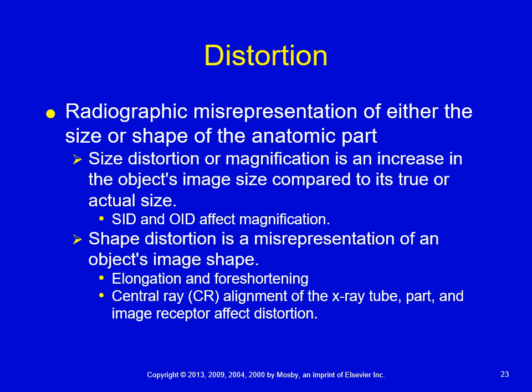If we did a right lateral, that means we're putting more distance. We typically don't do a right lateral, but if we did in the field, you're putting more distance between the heart and the image receptor, and potentially that would induce a lot more magnification. Now, you want to ensure that you always use the standard SIDs, because that magnification could occur in the image if you're not using those standard SIDs.